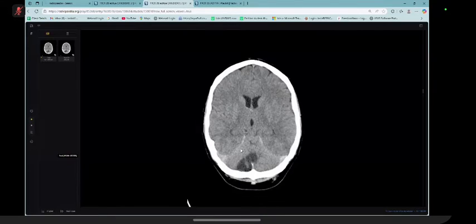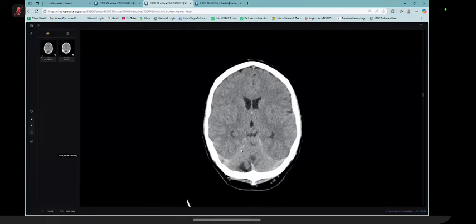Whenever you are seeing such a case, you can ask, I would like to check if any contrast scan images are available or not. If they have them, they will give them. If they say no contrast images, then you speak differentials. My top three differentials, as per the clinical question, could be cerebellar hemangioblastoma, or this or that.